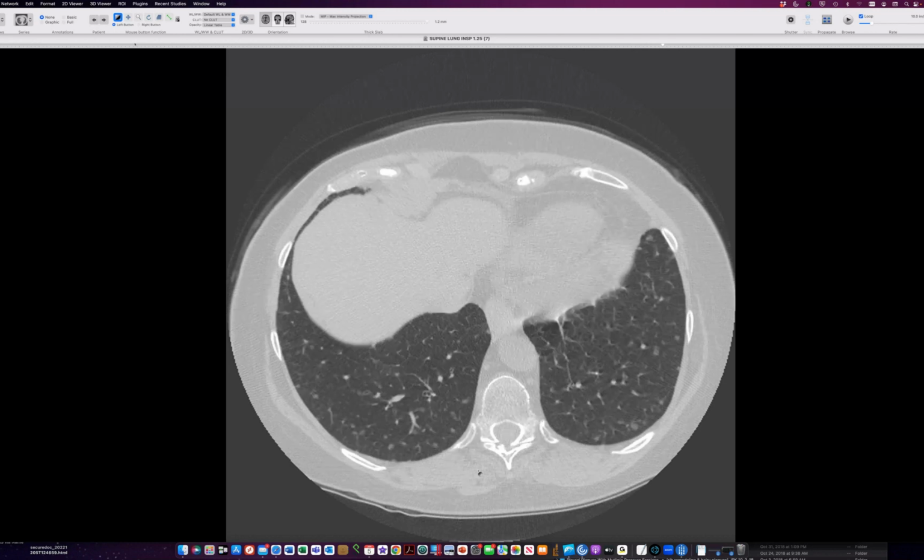I agree. Yep. I only see them in female patients, and they tend to be lower lobe predominant, and they're the kind of small shriveled up Cheerios that have been left around by a little toddler for a few days. These are Cheerios recovered from between the seat cushions. Right, exactly. They're the small Cheerios. But a lot of times, if you look at the smaller nodules, you can make out a subtle sort of umbilication. Yep. Yeah, very nice. I agree.